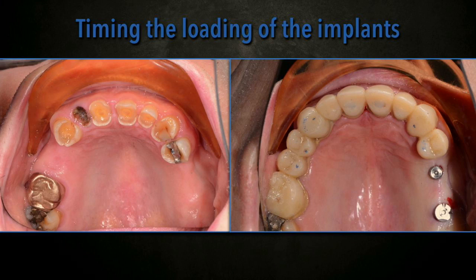We also placed 2 implants in the edentulous area on his upper left. U góry po lewej stronie wprowadziliśmy 2 implanty w odcinku tego braku skrzydłowego. And what we can do if we don't want to load those implants until the teeth have adapted. I co możemy zrobić? Możemy poczekać, implanty się będą wgajały, a w tym czasie zęby się zaadaptują do nowego wymiaru pionowego zwarcia.